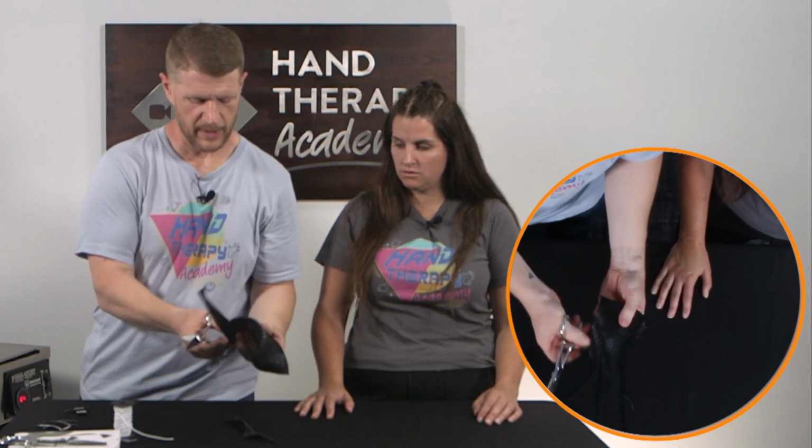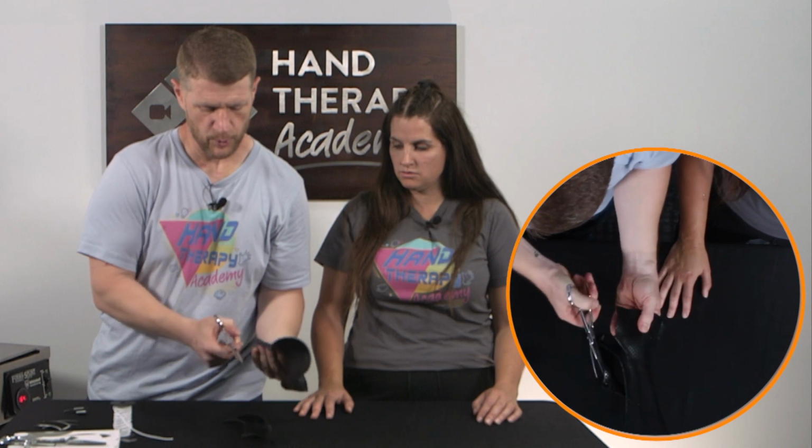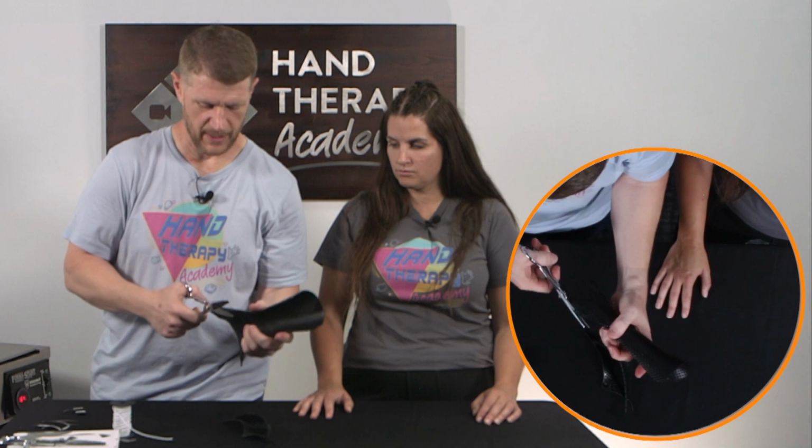Okay, so here I want to make sure I come a little bit wide for that thumb, so I'll cut right at the level of those holes so I minimize how much jagged edge I have there, and I'll round that just a little bit.